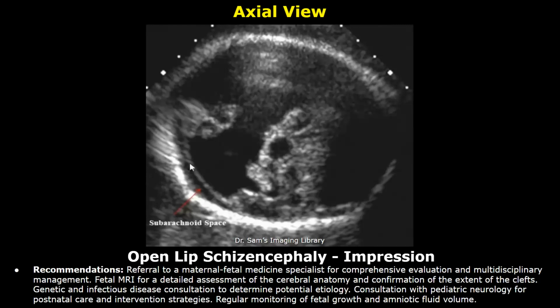Recommendations: referral to a maternal fetal medicine specialist for comprehensive evaluation and multidisciplinary management. Fetal MRI for a detailed assessment of the cerebral anatomy and confirmation of the extent of the clefts. Genetic and infectious disease consultation to determine potential etiology. Consultation with pediatric neurology for postnatal care and intervention strategies. Regular monitoring of fetal growth and amniotic fluid volume.